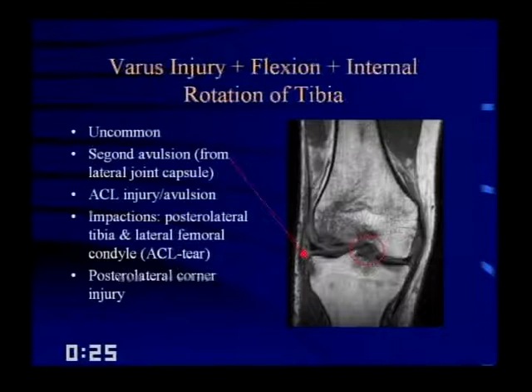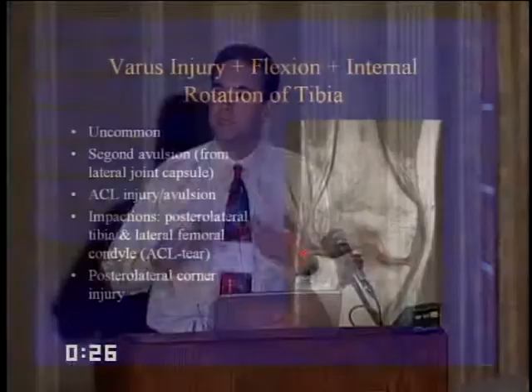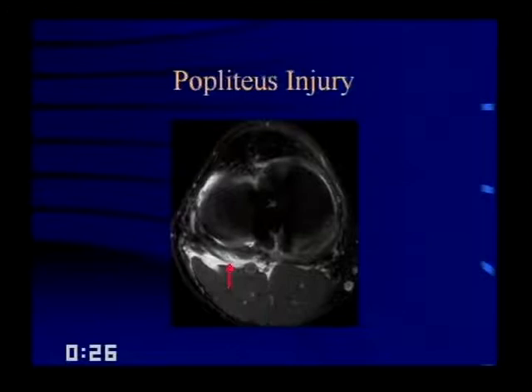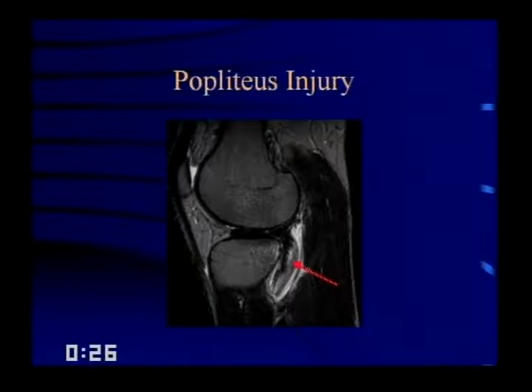These patients can also get a posterolateral corner injury, which is important to mention to the orthopedic surgeon as it warrants more aggressive treatment. Any structure in the posterolateral corner — such as the popliteus muscle — can be involved. Here's the popliteus muscle with abnormal signal within and around it, indicating a strain, confirmed on T2-weighted sagittal images. That is considered a posterolateral corner injury.